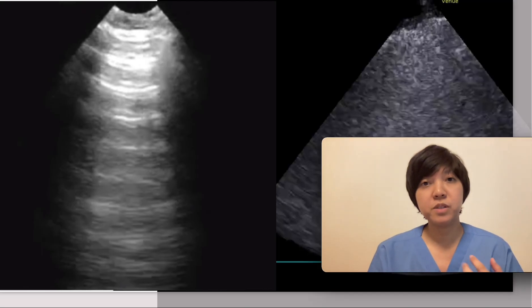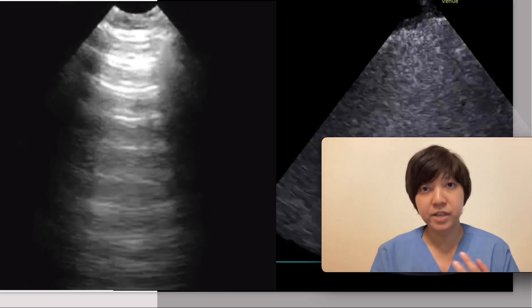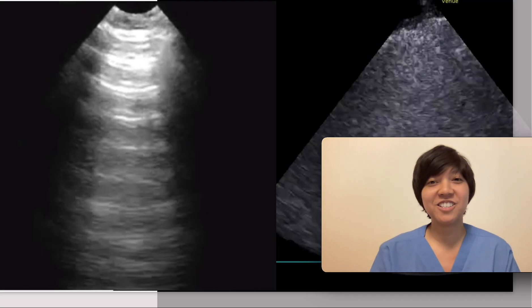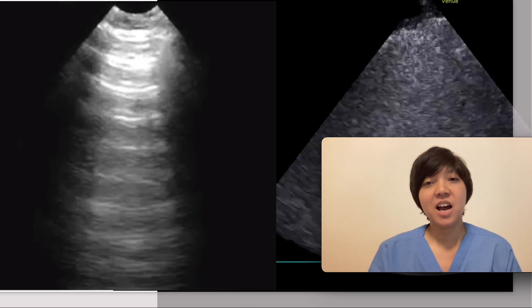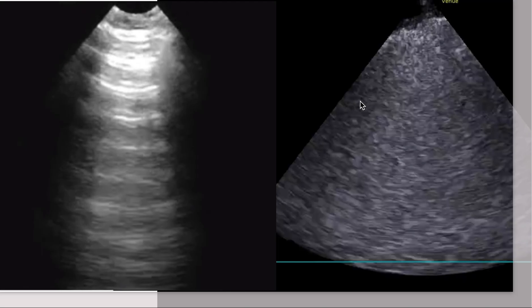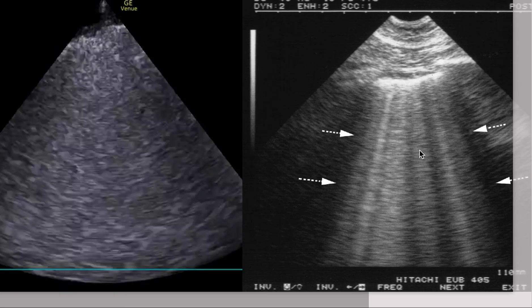In this patient it would mean that the patient maybe has dyspnea from COPD, asthma, or could be a normal patient as well. In contrast, if the patient has B-lines, it would look like this — B-lines are white vertical rockets which move and erase all A-lines.